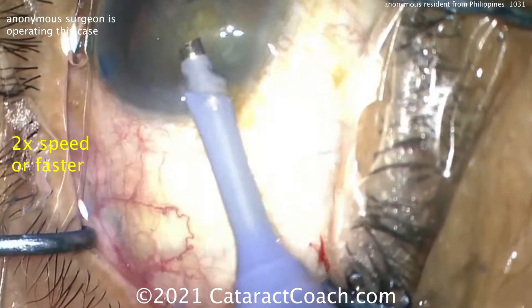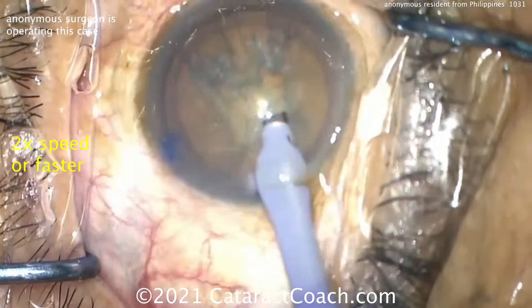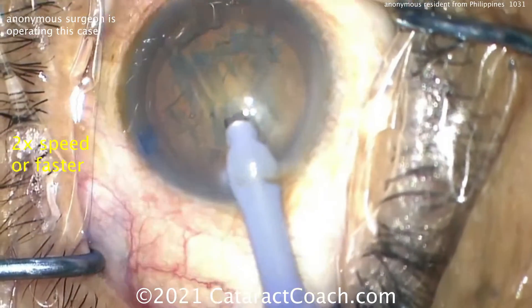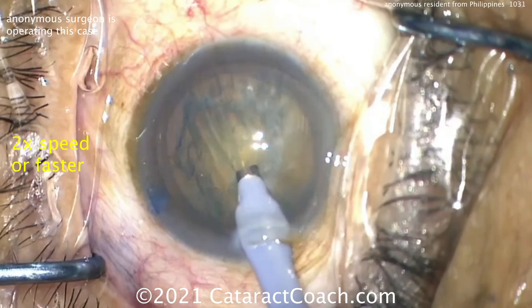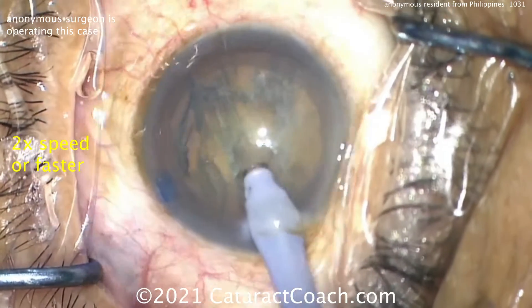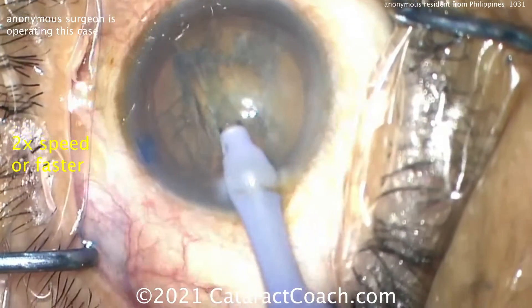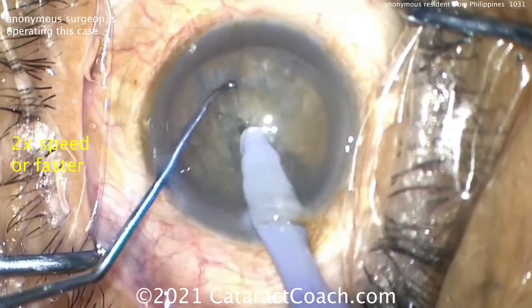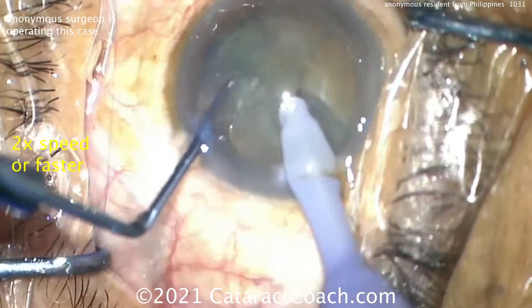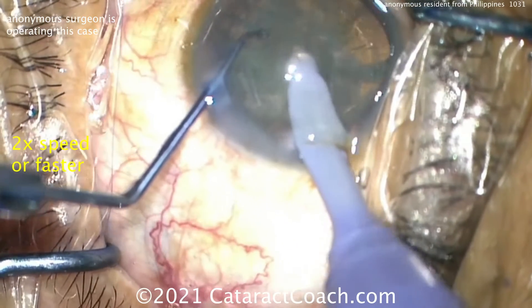No replacing of the viscoelastic. This surgeon is going to do a special chop technique where an initial pit is grooved to give more grabbing power during the chop. Here's that little pit made in the sub-incisional to central zone of the nucleus. This gives you better purchasing power as you place the chopper opposite it — so even if you don't have full vacuum, that pit makes it easier to trap the nucleus between the two instruments.